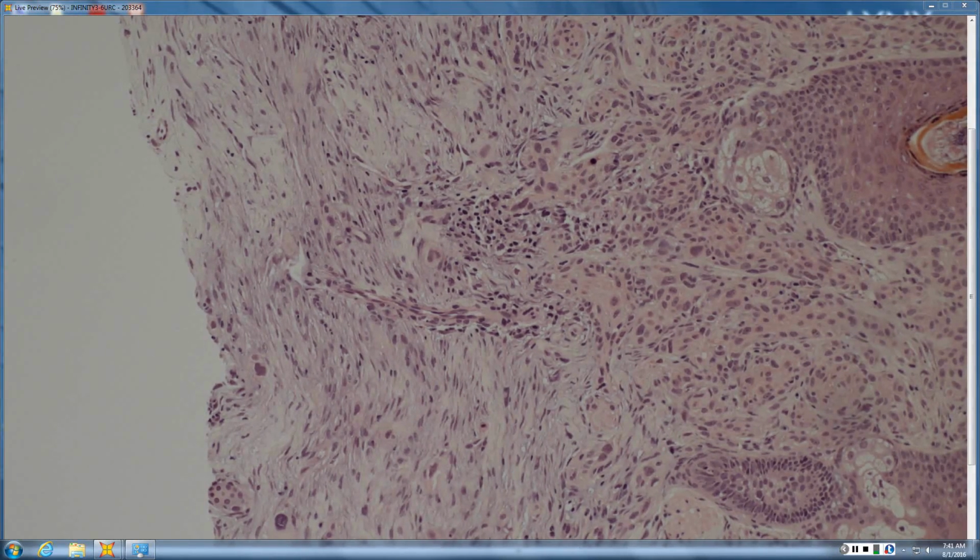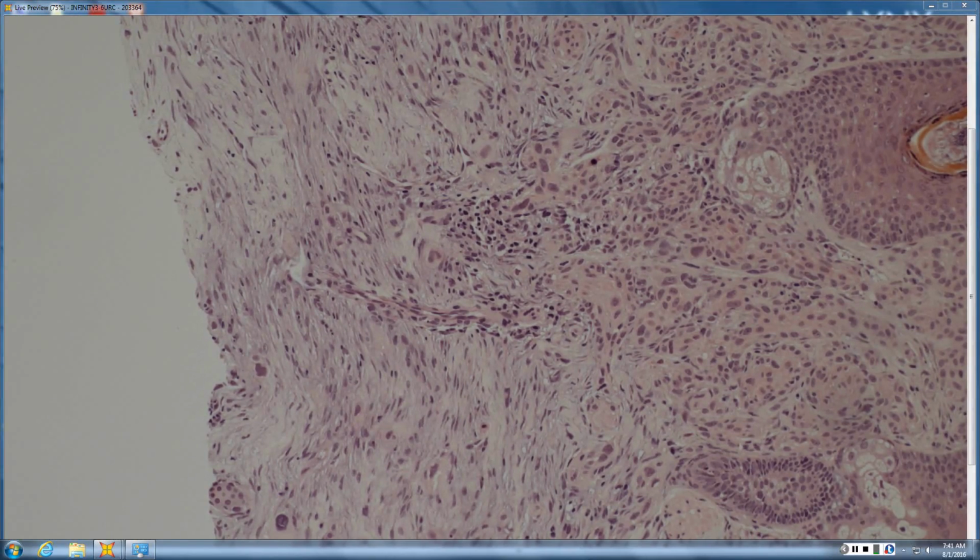So what immunostains might you choose to use? Like pan-keratin. What else? Other keratinocyte stains, yes. I don't really know other ones. So, anyone want to jump in with what other ones? P63. So P63, excellent, which is a nuclear stain, which is much more specific.